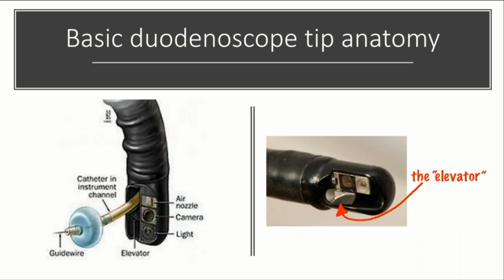We should not forget the duodenoscope anatomy. The duodenoscope has two major differences in comparison to the classic scopes. It is side viewing, so whenever we're pushing the scope, we see from the side. What I used to say to the trainees in the past, when I was working in a public hospital and I was trained in ERCP, is that it's like walking in this room and looking down.